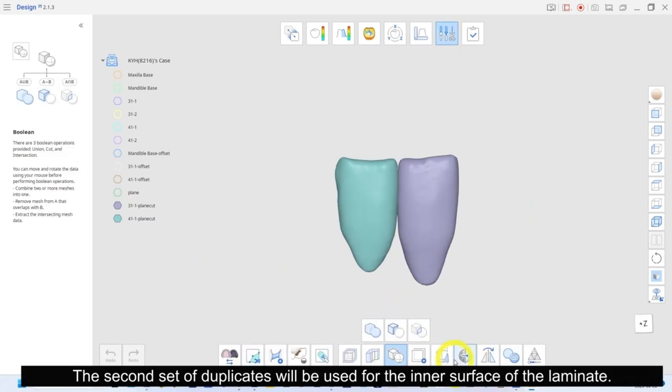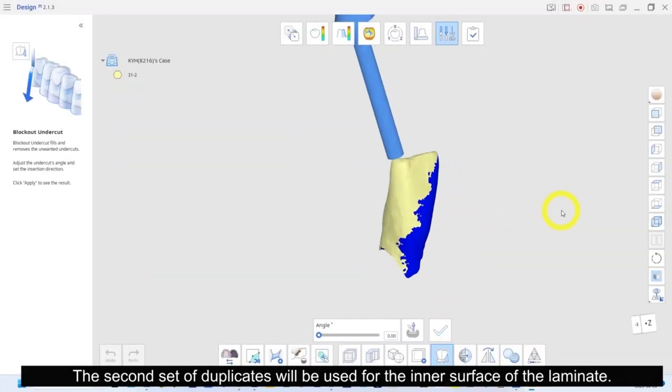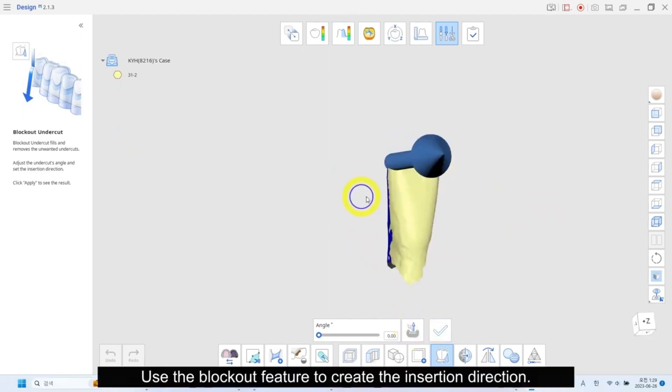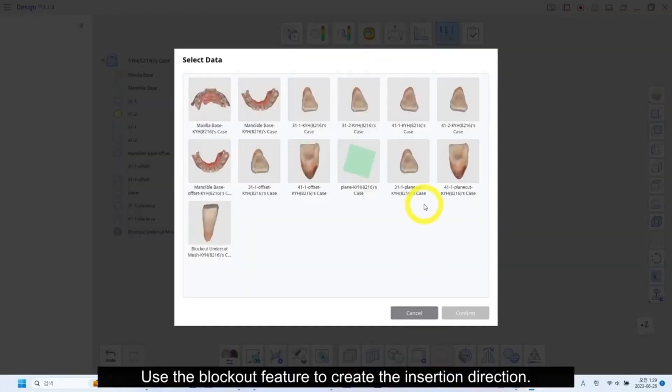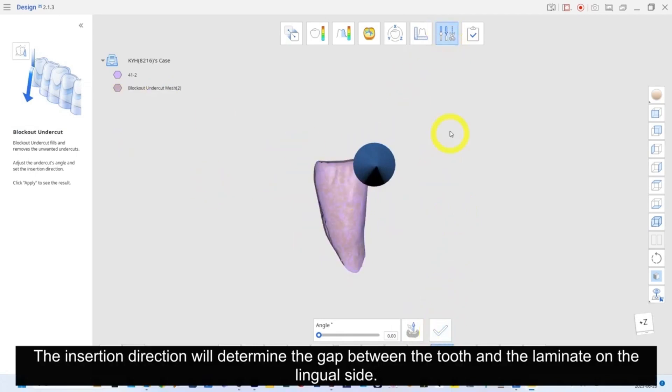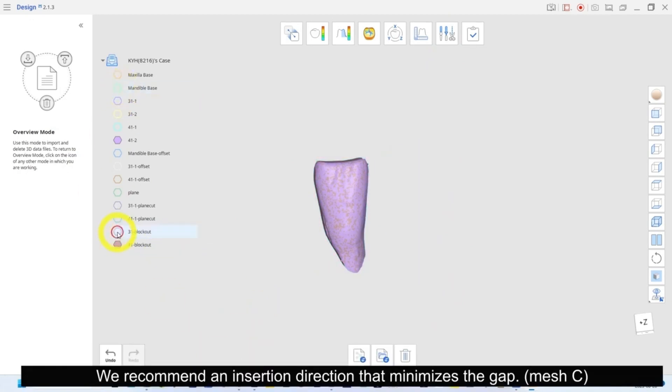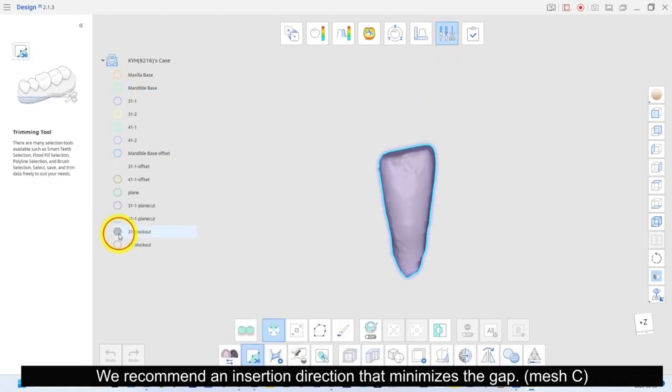The second set of duplicates will be used for the inner surface of the laminate. Use the blockout feature to create the insertion direction. The insertion direction will determine the gap between the tooth and the laminate on the lingual side. We recommend an insertion direction that minimizes the gap.